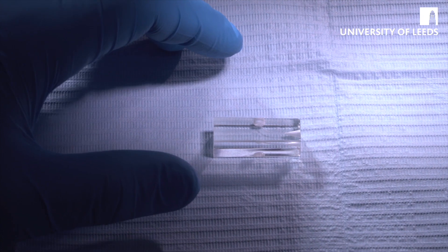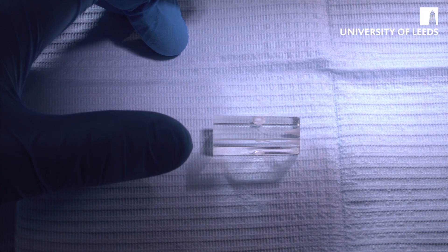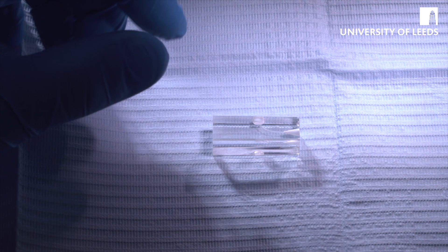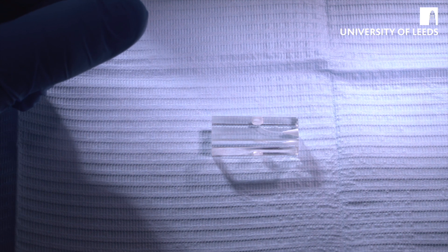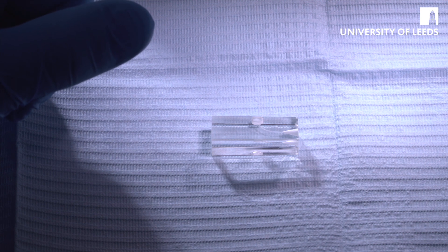The first demonstration is for the use of ProTaper Gold in a curved canal system. One of the drawbacks of ProTaper Gold is the number of files it uses. That is both a drawback and an advantage in some ways, because it means you can really use the files to change the shape of the canal in the way that you wish, compared to single file systems.